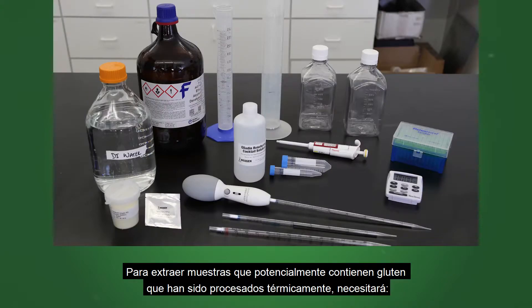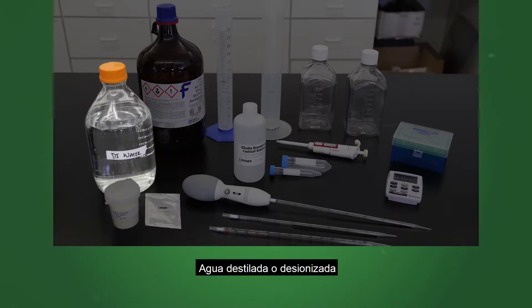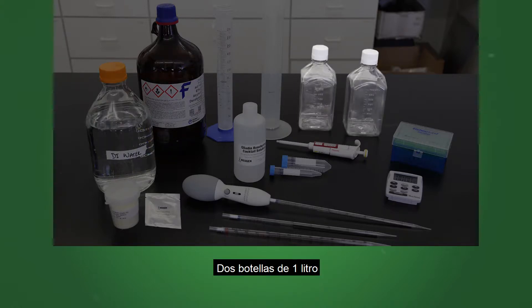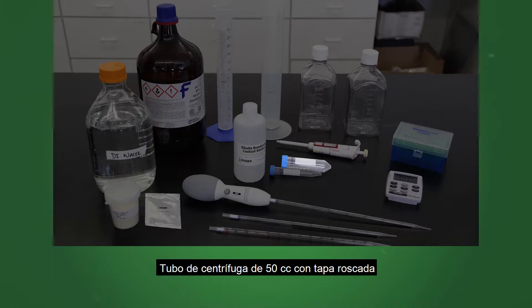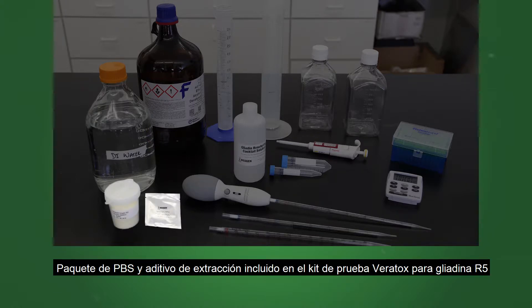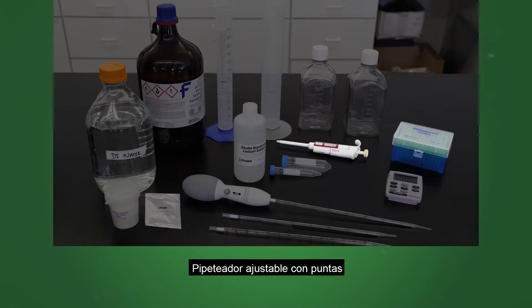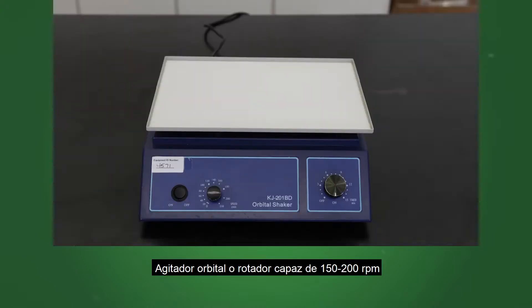To extract samples potentially containing gluten that have been heat processed, you will need: Gliadin Renaturing Cocktail Solution, ethanol, distilled or deionized water, two 1-liter bottles, a scale to weigh 0.25 grams, a 50 cc screw cap centrifuge tube, a 10 milliliter tube, means to measure 2.3 to 7.5 milliliters, PBS packet and extraction additive included in the Veratox Gliadin R5 test kit, a timer, adjustable pipetter with tips, water bath or oven at 50 degrees Celsius, and a shaker or rotator capable of 150 to 200 RPM.